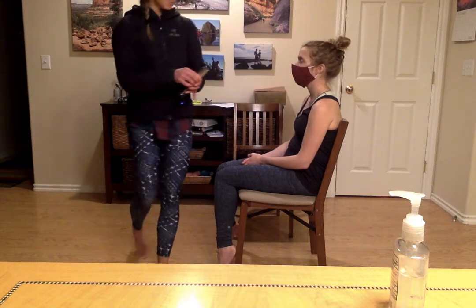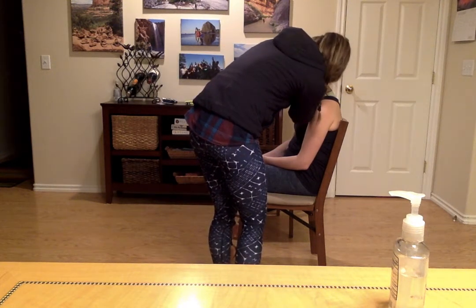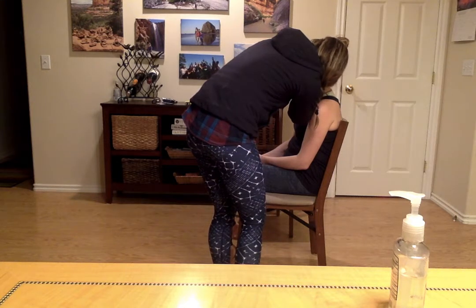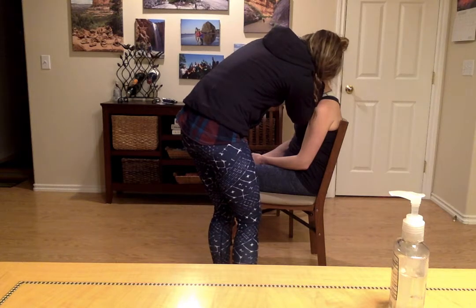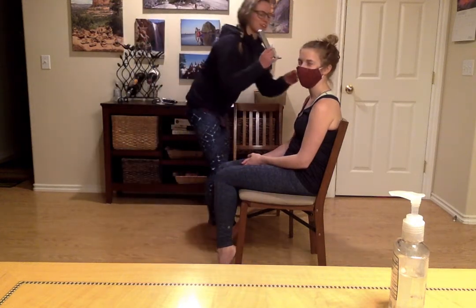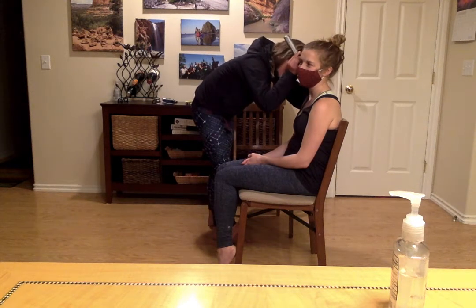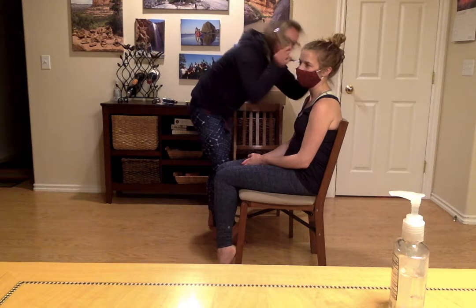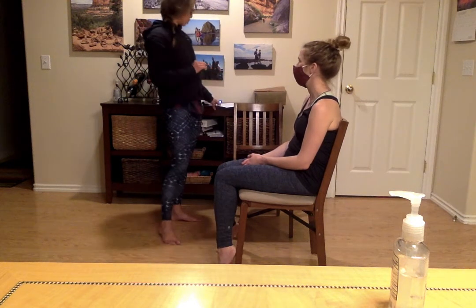So we'll come in and just pull up the ear, and we're able to visualize the canal. It is nice and clean, and I can visualize the tympanic membrane. It is silver and a good pearly gray with a good light reflex. And same thing on the other ear here, just pulling back. And I can visualize the canal. Everything looks great, and again, silver and pearly with the tympanic membrane intact. No obvious signs of bulging or issues.